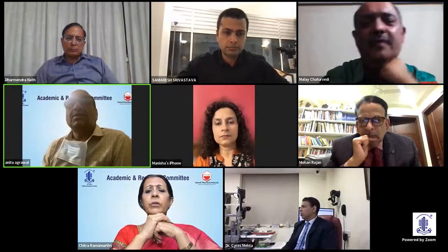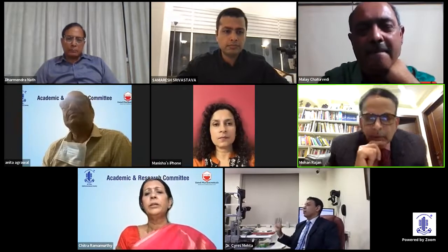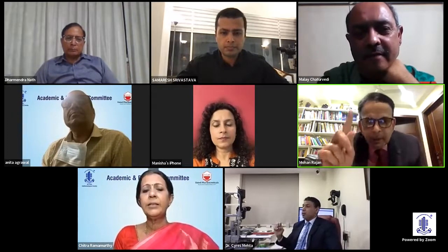Single-piece lenses, one is having 5-degree angulation, one is 6-degree angulation. Okay. Chitra, can I add one thing? No financial interest. Yes, Mohan. Yeah.